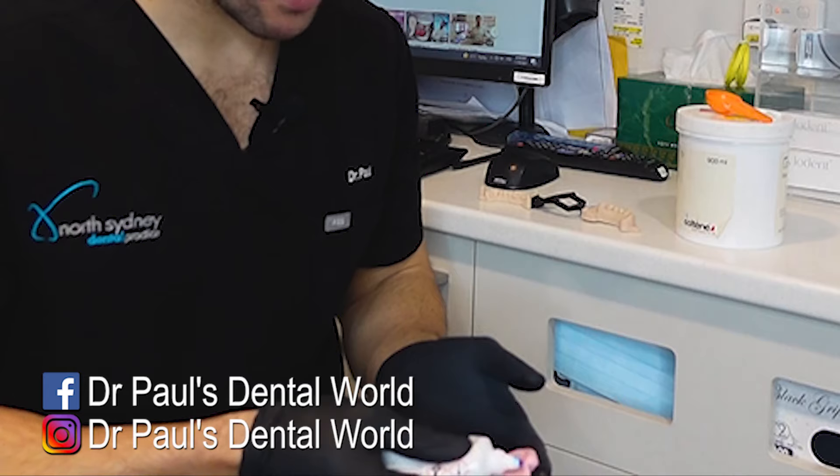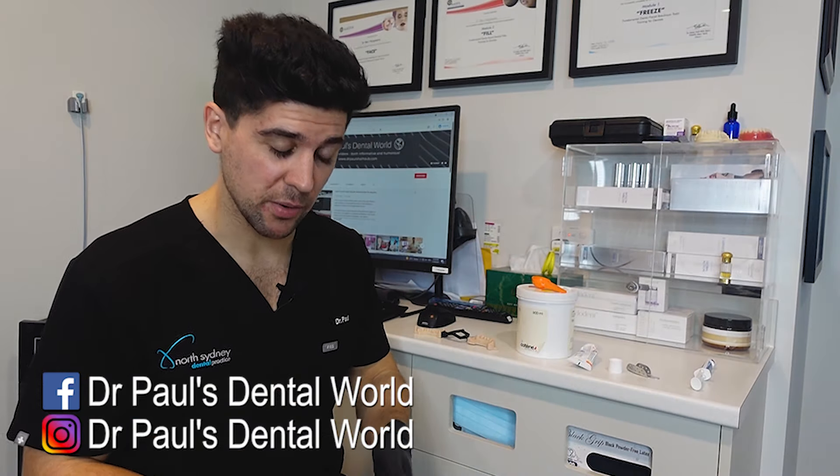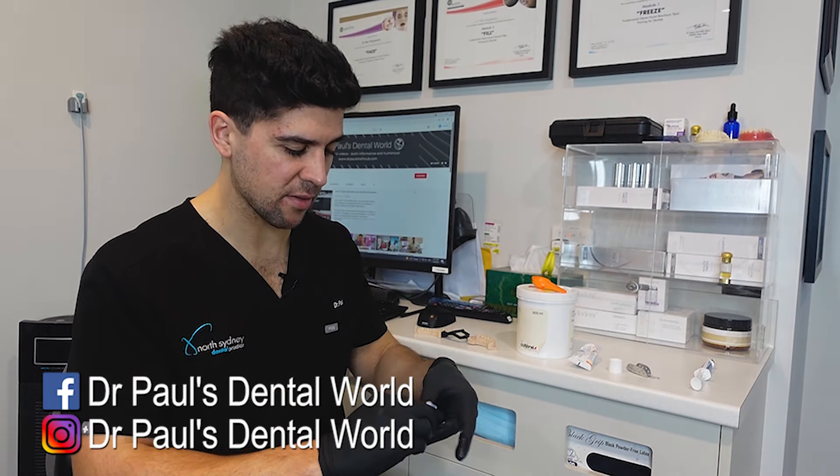So now we're gonna make our putty index. Now this is a stage that we normally do while the patient is going numb. So as I'm giving the local anesthetic, my assistant will start mixing this. So when I finish giving the local anesthetic, this will be ready to go into the mouth.